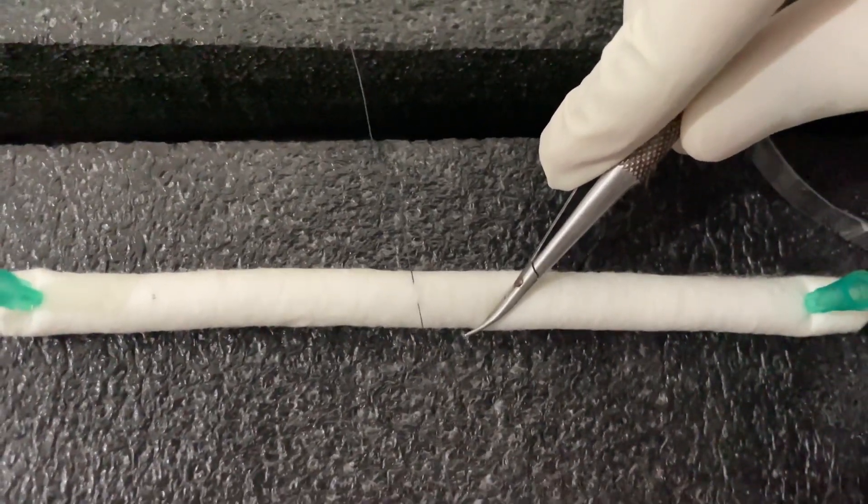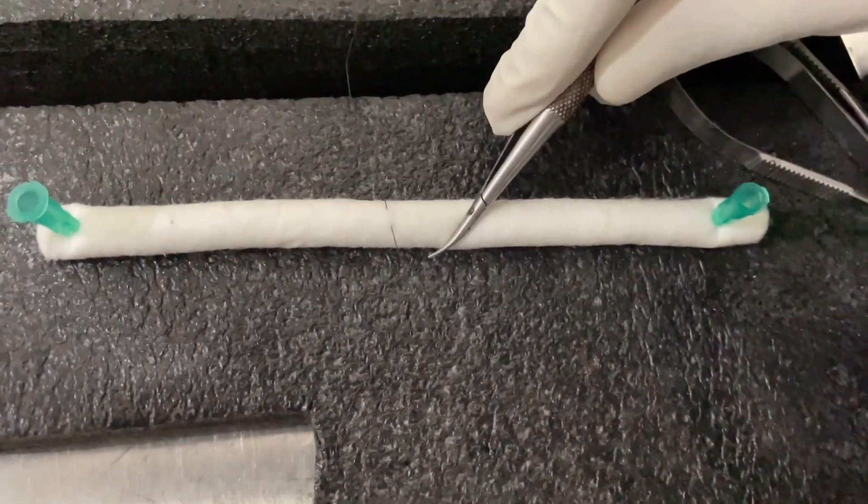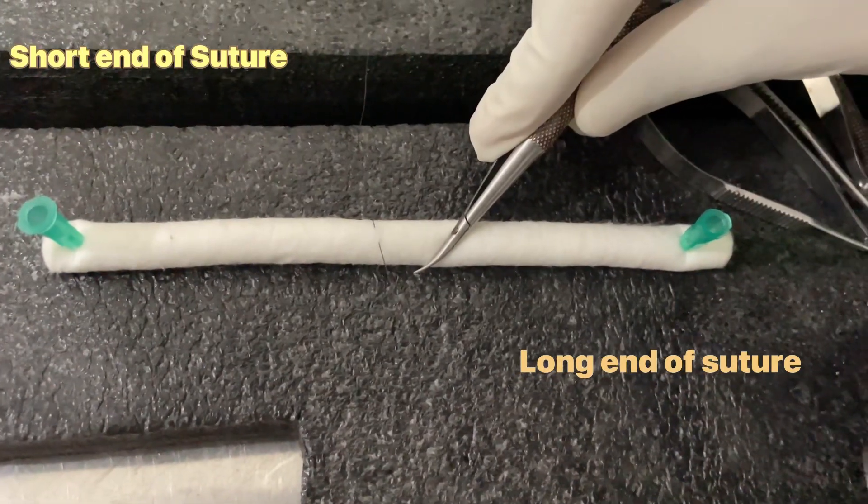Now, extract the needle with the needle holder. The upper end is the short end of the suture and the lower end is the long end of the suture.